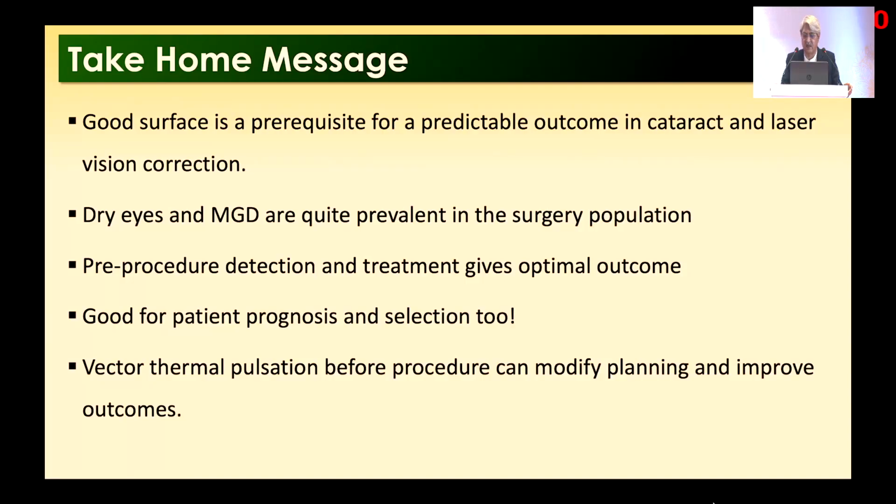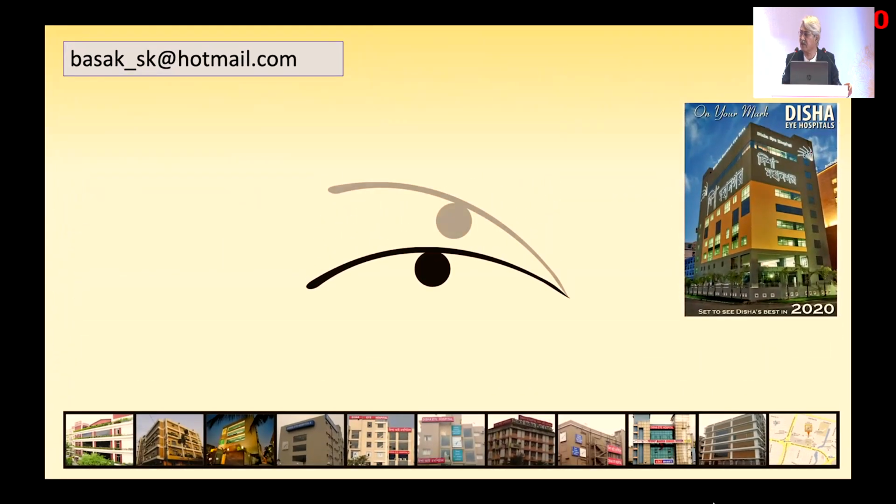And it is good if your selection is good, like I showed some of the pictures with severe meibomian gland loss. If there is no meibomian gland, then it will not act, because there should be some amount of meibomian gland. So it is actually working in most of our cases. You exclude those cases. Thank you very much.